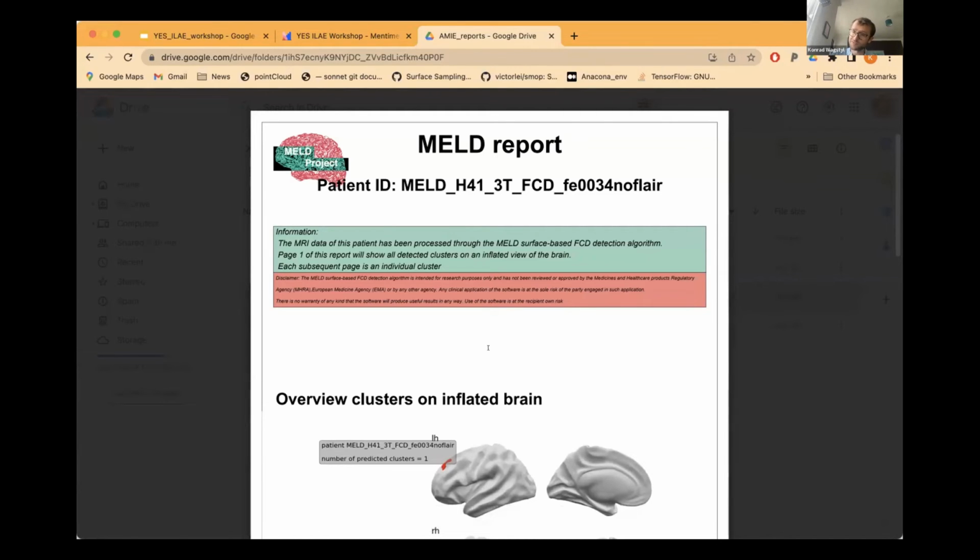I mean, FreeSurfer is notoriously not great with motion, and things like thickness start to get messed up. There are scans with motion where we're picking up the right areas, but it's generally the noisier the scan, the harder it is. In our first piece of work, back in 2016, this was just done on Great Ormond Street, we had 30 scans in total, so it was quite a small data set, but we blindly rated scans for motion artifacts, and that tended to be the biggest predictor of missed lesions. So in short, it's not very good, but I think the human eye also struggles with motion artifacts.